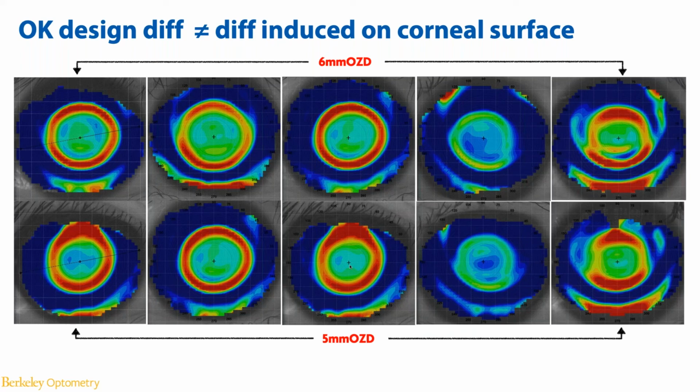And my second indication moving forward, if I'm seeing someone with some level of anisometropia, I will probably do a mini test of fitting the higher myopic eye with a 5 OZ and the lower myopic eye in a 6 OZ to see clinical performance-wise, topographical changes, whether I see a difference. So those would be my top 2 indications of using the 5 OZ.